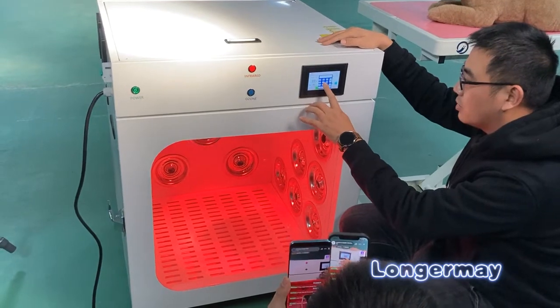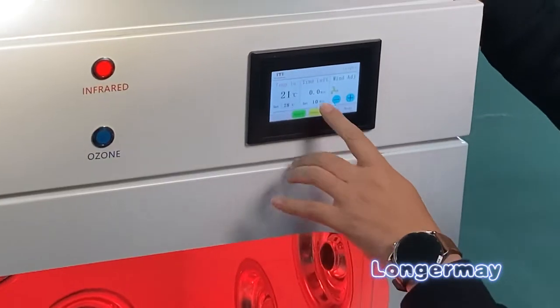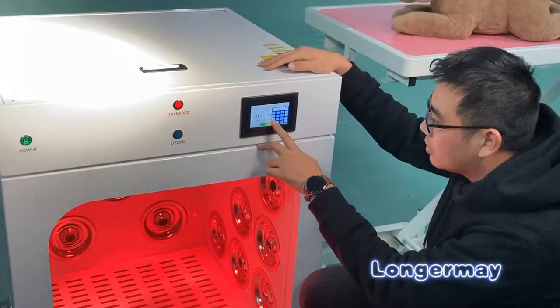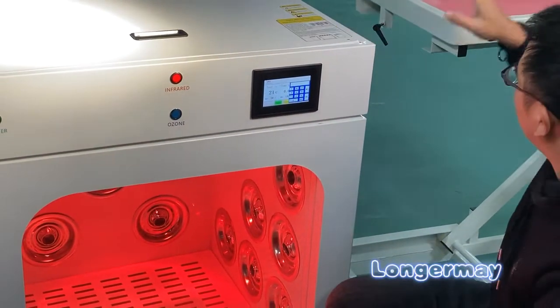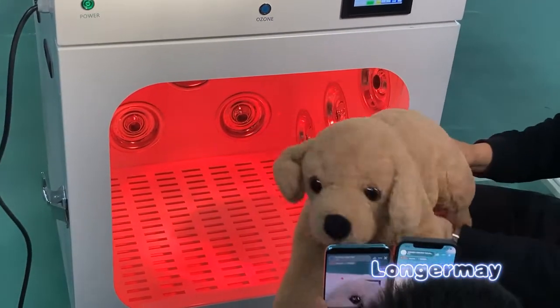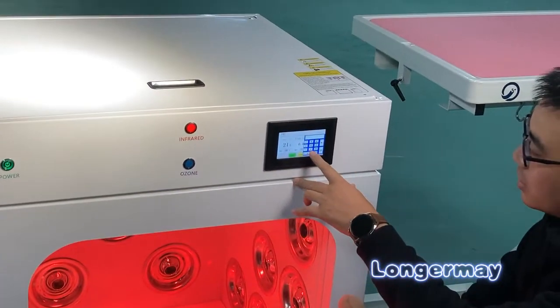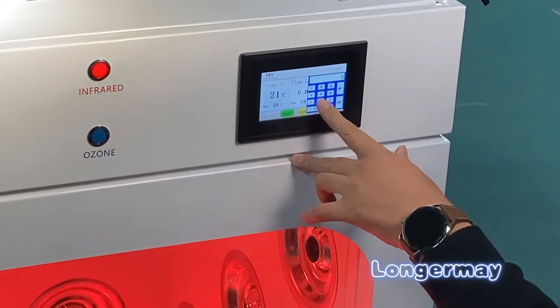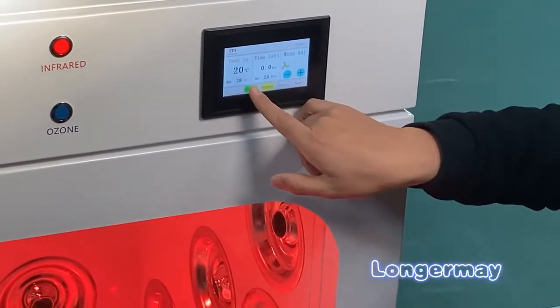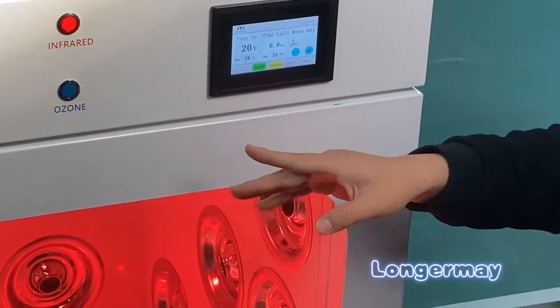And now the temperature we can also set. We can set 28 degrees. And also for the dry time, we can set. For dogs like this, about 10 kg, we always need 25 minutes. We can set 25 minutes. After we press start, it will dry for 25 minutes.